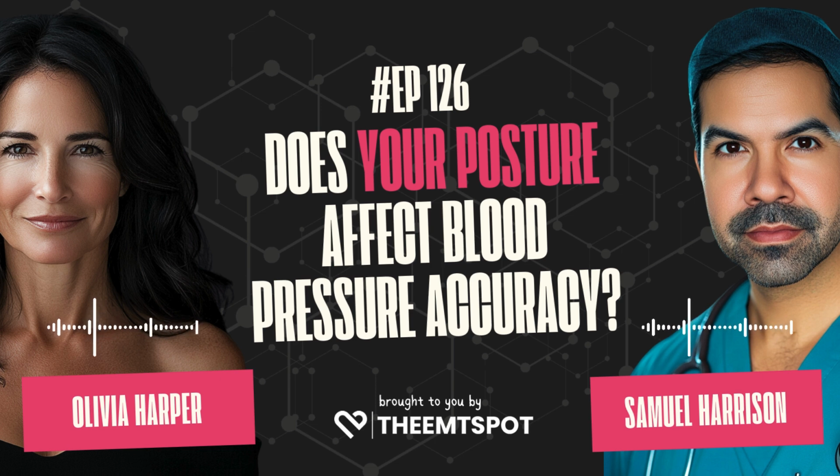Well, research shows that when patients sit on the exam table with their legs dangling, their readings are significantly higher compared to sitting properly in a chair. Higher meaning it looks like their blood pressure is worse than it actually is. Exactly. And we're not talking about tiny, insignificant differences either. A study in the Lancet's eClinical Medicine found that readings taken on the exam table with dangling legs were a full 7 mmHg higher for systolic pressure, and 4.5 mmHg higher for diastolic compared to sitting in a chair. 7 mmHg. That's not just a blip on the radar. That could be enough to push someone into a whole different blood pressure category. Absolutely. Those seemingly small differences in millimeters of mercury can have a big impact on how your blood pressure is classified, which in turn affects what your doctor recommends for treatment.